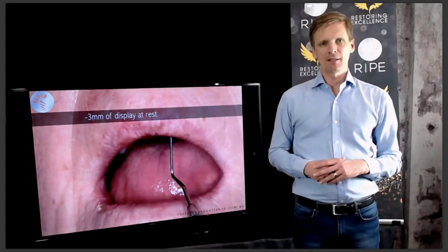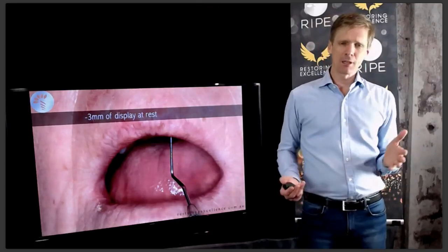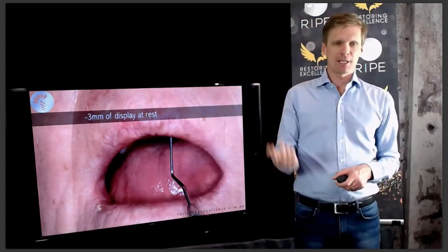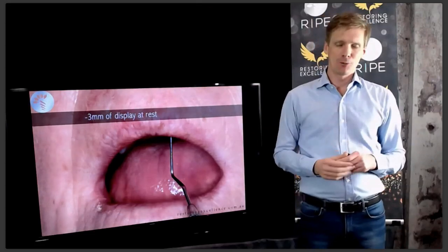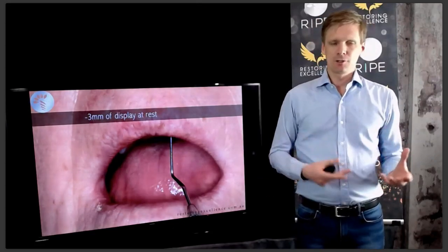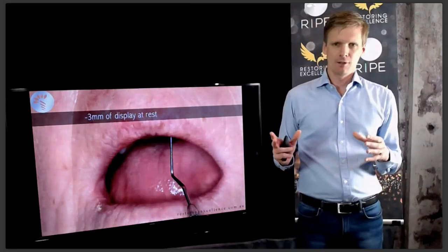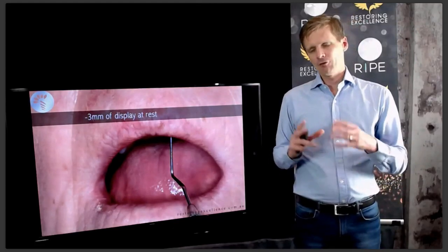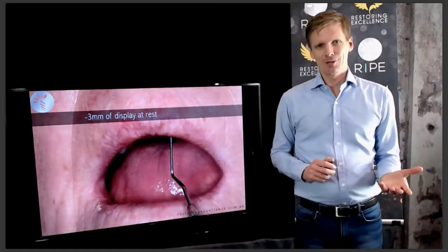Otherwise, you say, open your mouth, and they do a big grimace or a snarl at you. So drop the lower jaw and take a photo. Now, for a lot of patients, the teeth are level or they're just showing, but for some patients, the tooth is sitting way up under the lip. Unless you put a perio probe, you don't know how far under the lip it is. You can also get some of these results with digital smile design techniques, and digital smile design techniques are really an extension of Frank Spear's facially generated treatment planning. And Frank Spear's facially generated treatment planning comes from original denture making techniques.